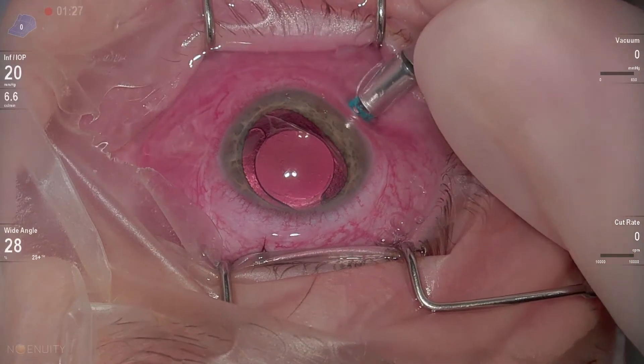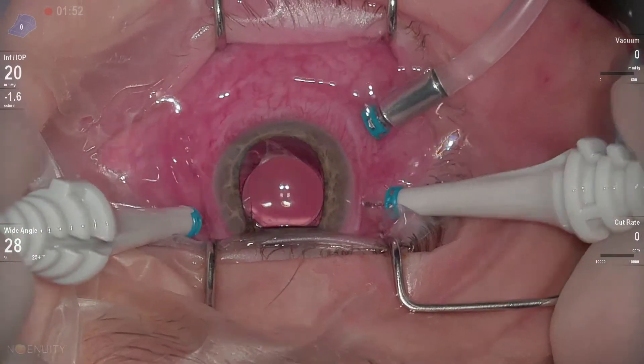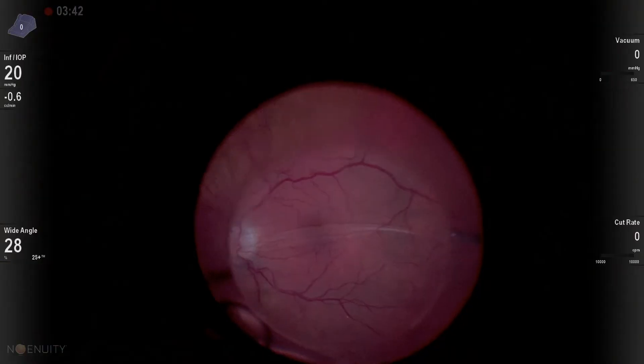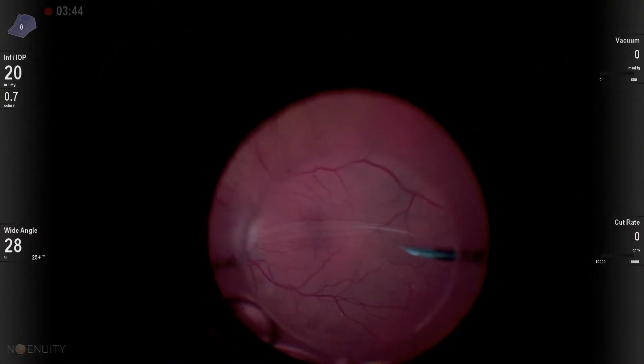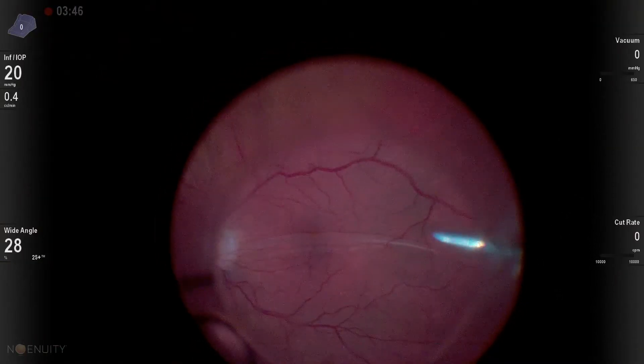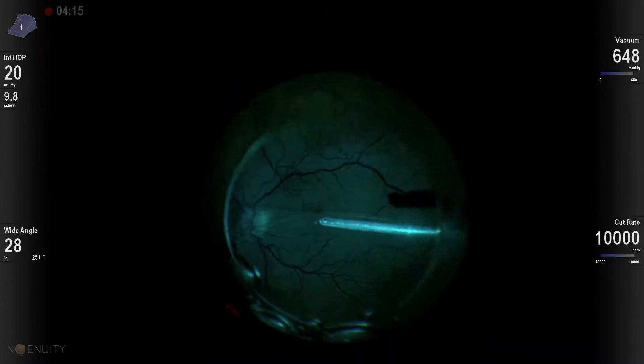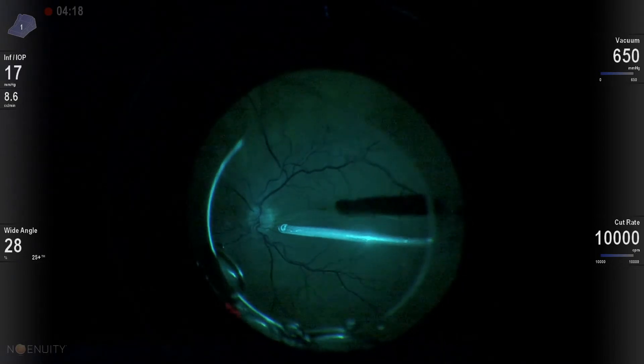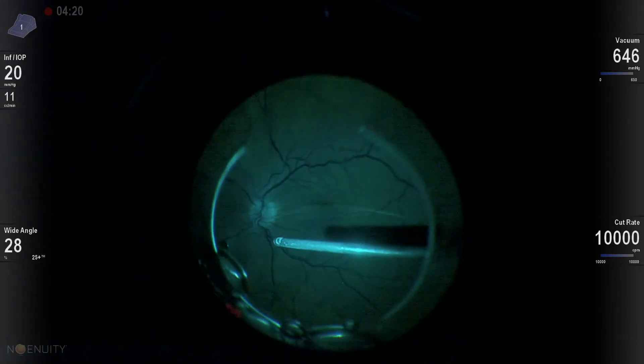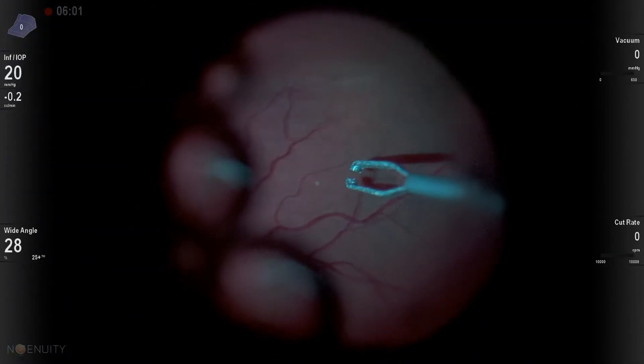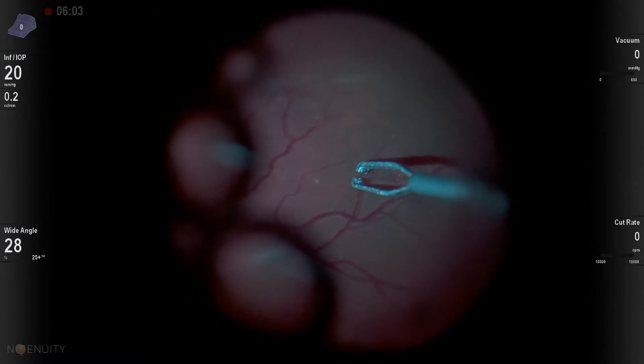This was a very unusual and unique case that I did recently. This was a patient that had a retinal detachment, and I've repaired him with a pars plana vitrectomy using PFO, and normally with PFO you won't end up with a macular fold.